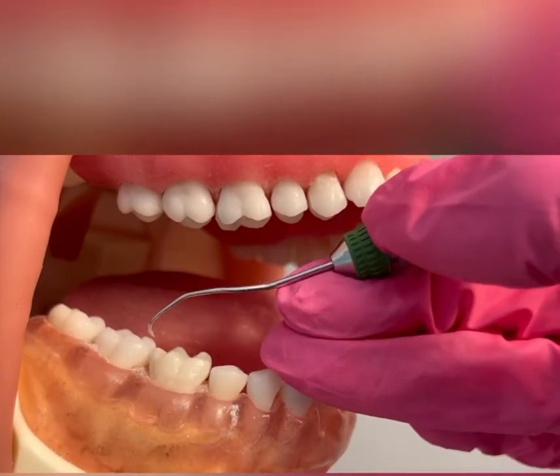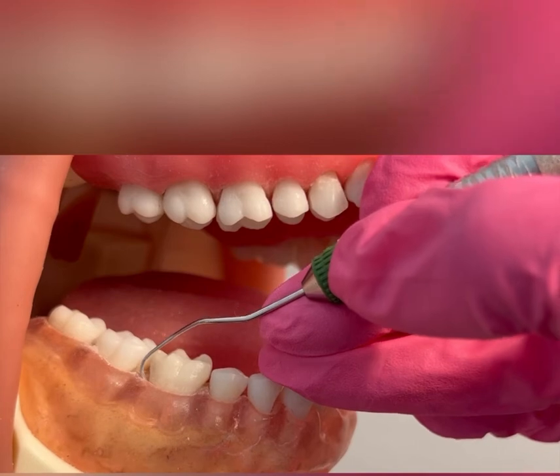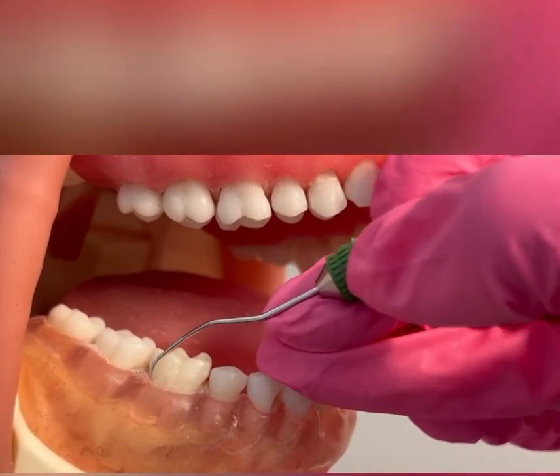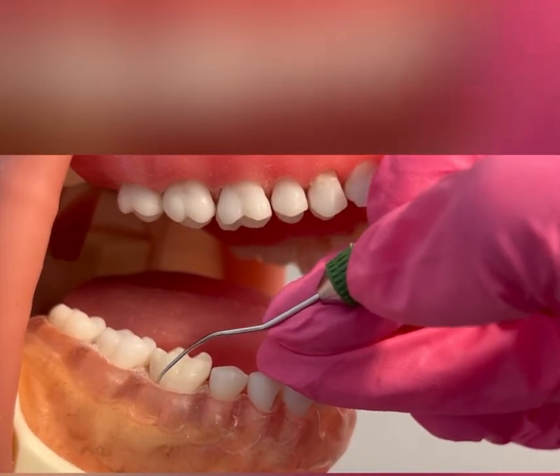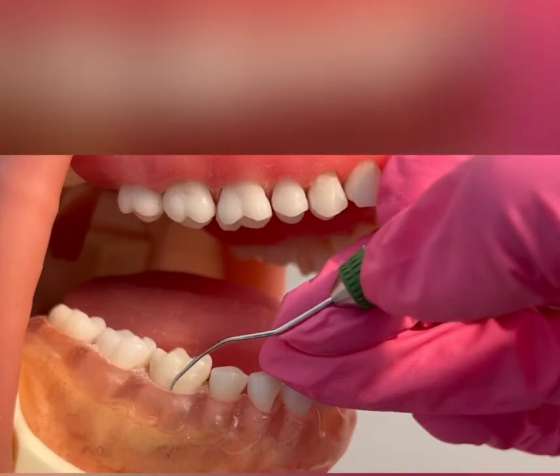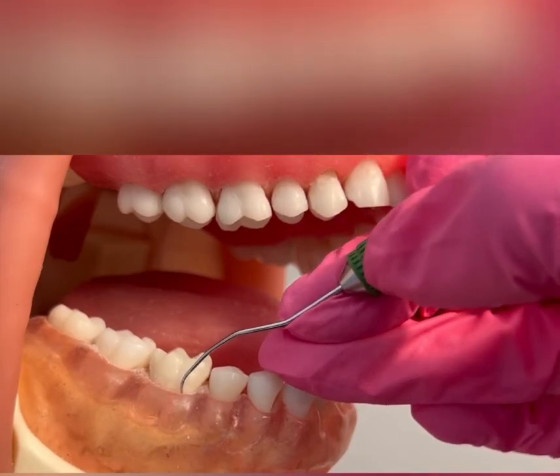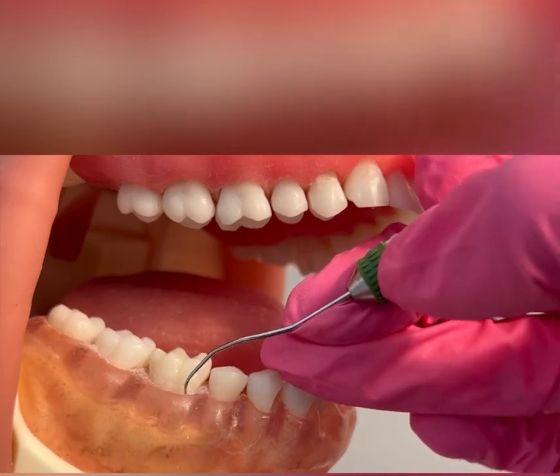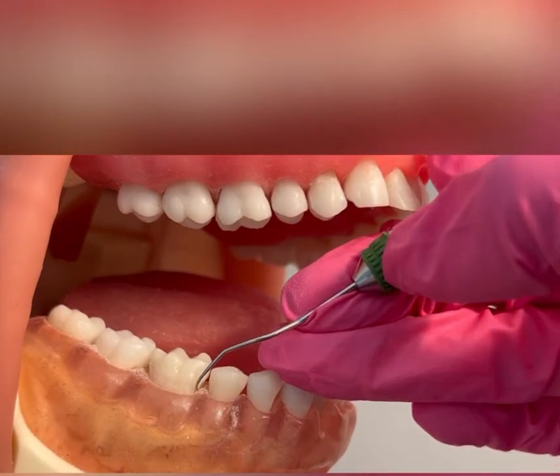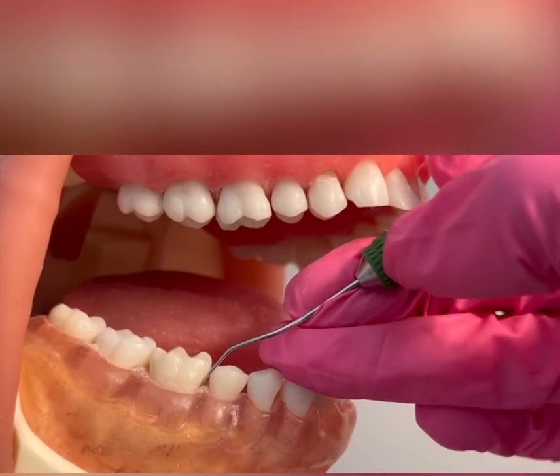Come out completely. Quarter turn. Make sure you have a good modified pen grasp — your index and thumb should be opposite each other. I'm inserting back at that distal buccal line angle; now my tip is coming towards that mesial. I'm using a very light grasp, an oblique stroke across — a diagonal motion — wrist activating, maintaining my modified pen grasp and good ergonomics. I'm coming up on my fulcrum as I roll into the mesial interproximal. Roll the handle between your index and thumb, staying adapted with one to two millimeters of the working end. Now vertical strokes — really overlap. Feel the calculus, use your tactile sensitivity. Going 51%, more than halfway into that mesial.